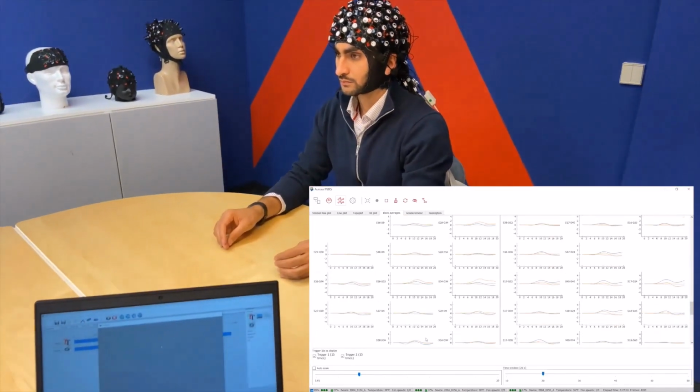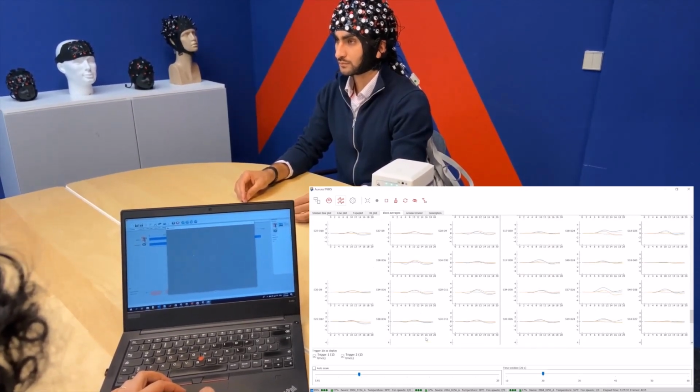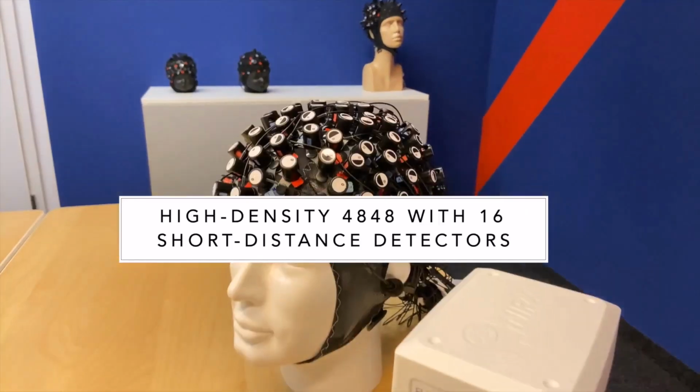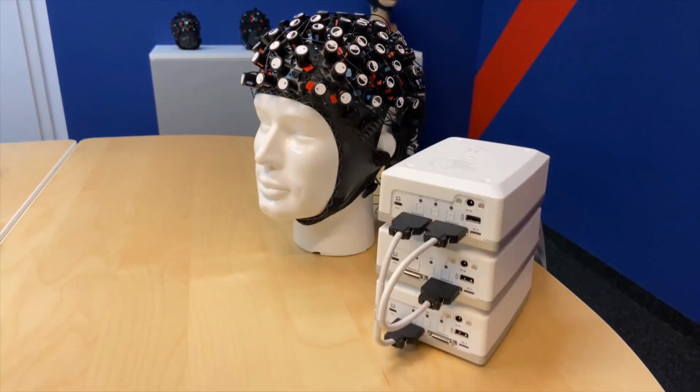They should look somewhat like the curve that we saw on the previous slides. Okay, so that's just one possible way to investigate the hemodynamic response in the brain with that finger tapping task. Using fNIRS, there's a whole host of other ways to investigate neural activation.